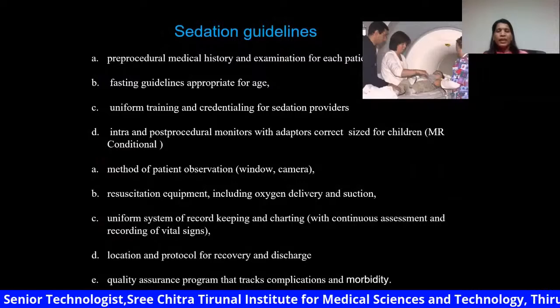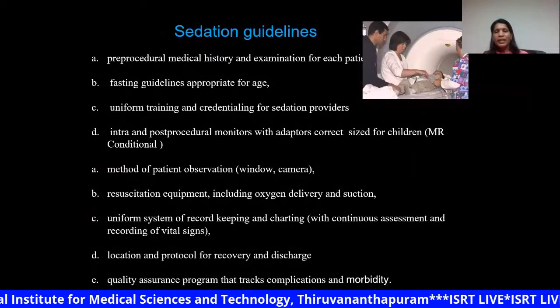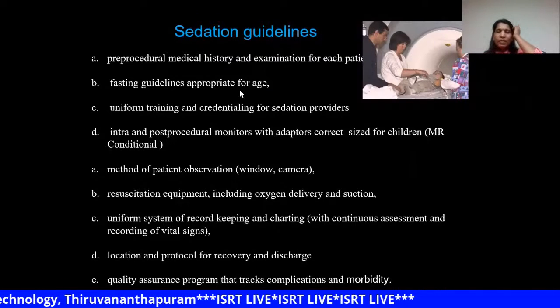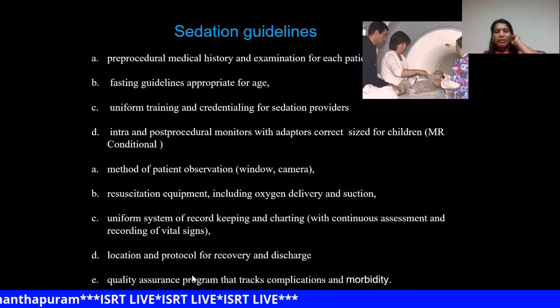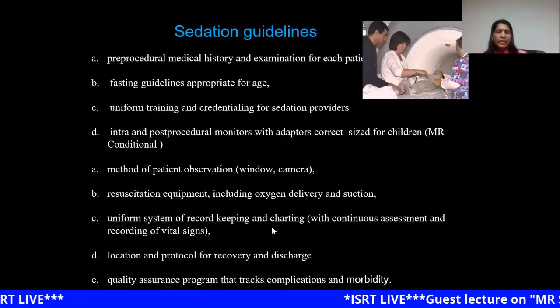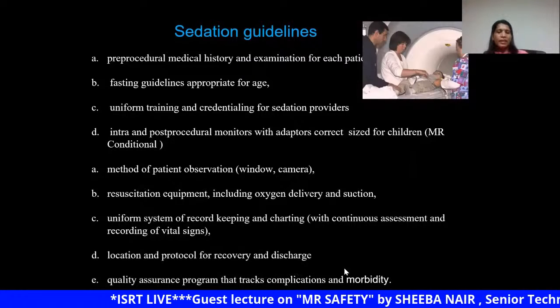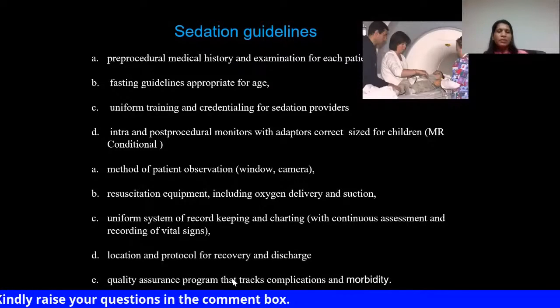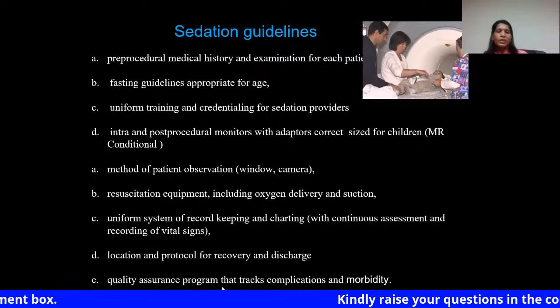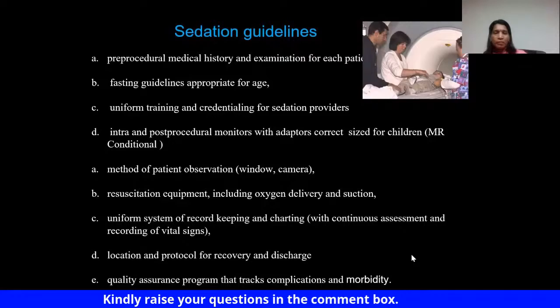Each institute should have guidelines for sedation, and it should be done by trained personnel. And also we have to keep a record of the patients undergoing MR imaging under anesthesia, and we should have a quality assurance program to track the complications and morbidity.